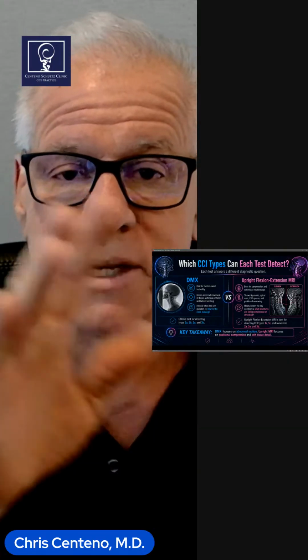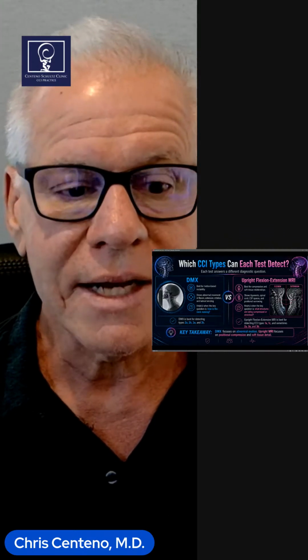Now, there are other types there: type 1B, too far back this way, type 1D, rotational, type 1E, vertical, but I'm just talking about the most common ones here. But DMX doesn't do well with those type 1s, whereas upright flexion extension MRI does do well with those type 1s.